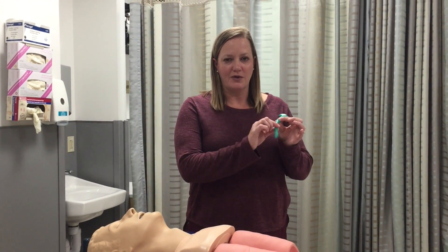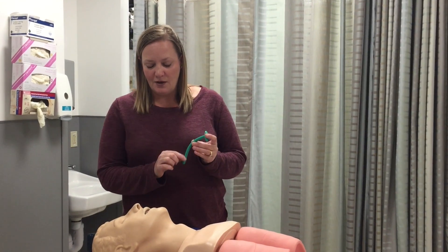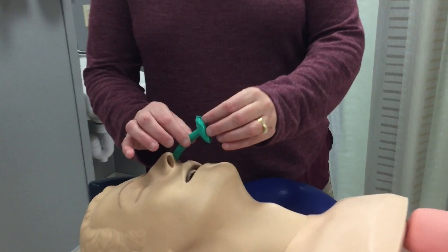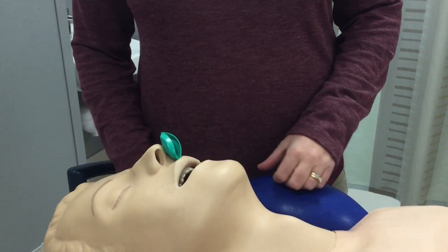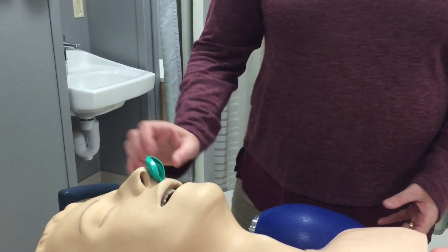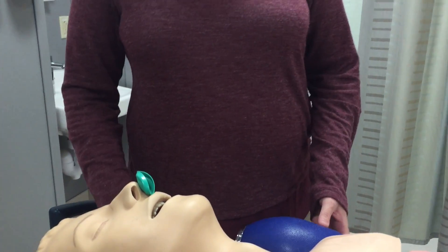What you do is you just lube up this nasal airway and you just slide it into the nose, and it should go in fairly easily all the way down. And that way, when you're placing oxygen on the patient, their airway is a little bit more open.